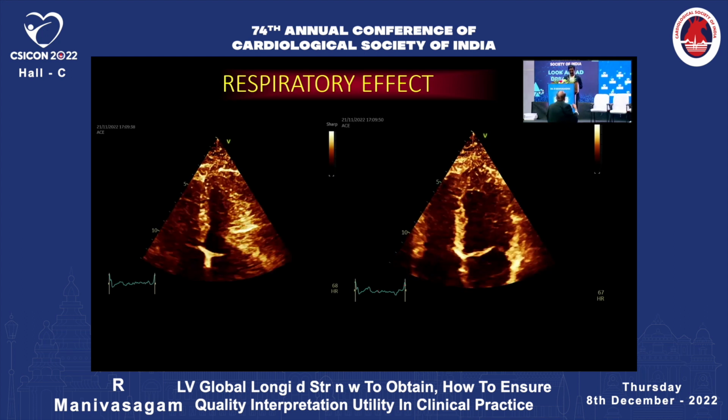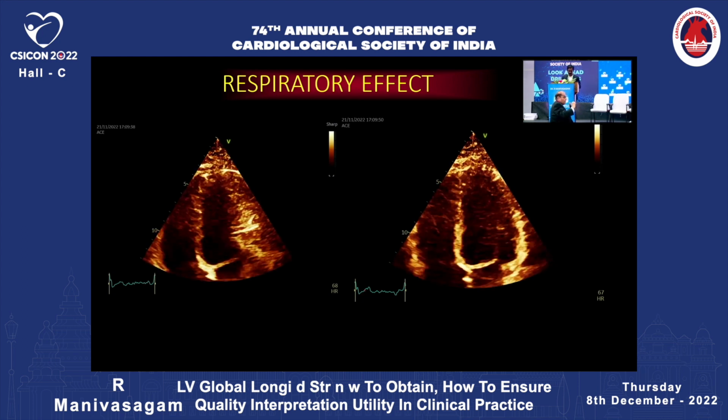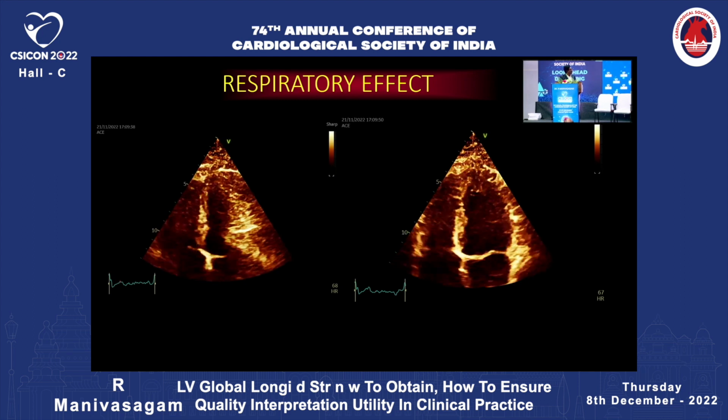Yeah, that's just to make sure. All the segments are averaged, and you give that mark. Yeah, you get the peak from each segment and then you average it. So it's a peak, average, global strain. That's peak. Exactly. Thanks.